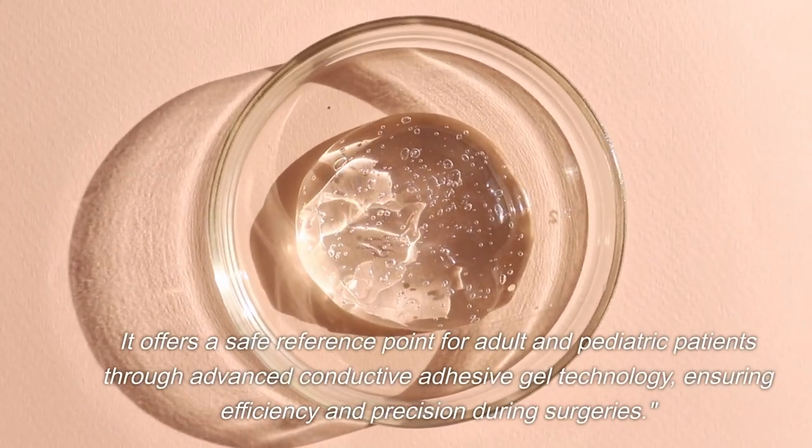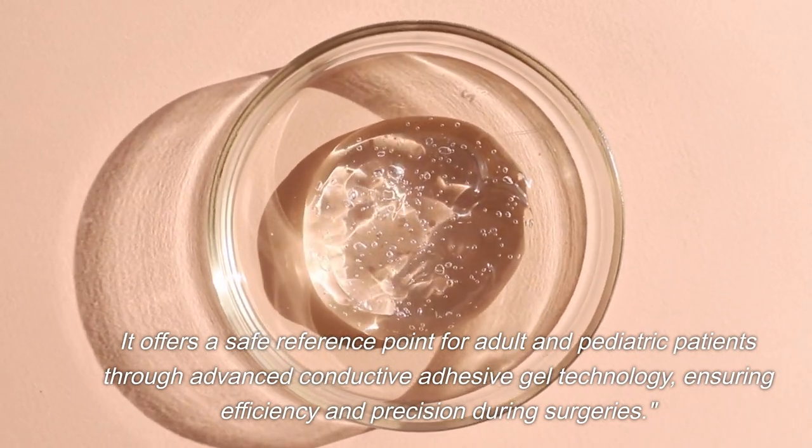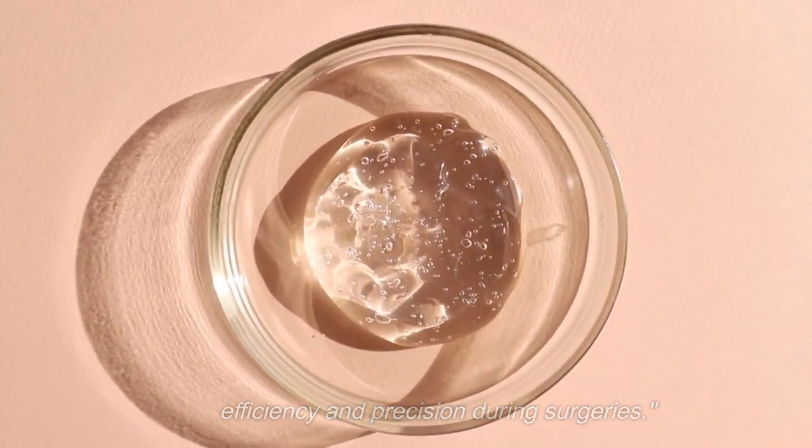It offers a safe reference point for adult and pediatric patients through advanced conductive adhesive gel technology, ensuring efficiency and precision during surgeries.